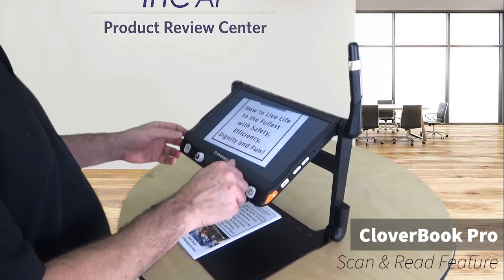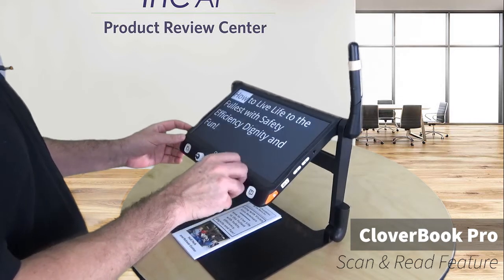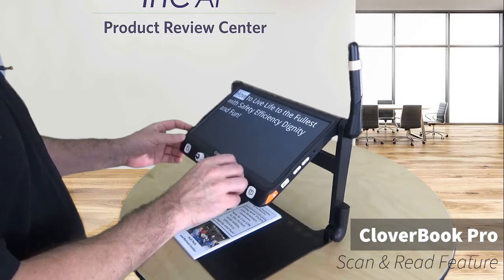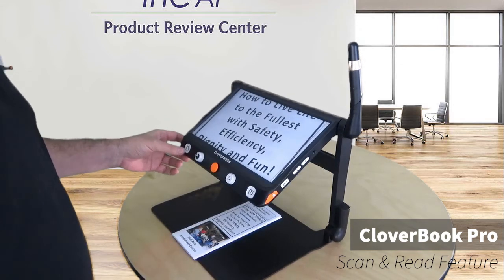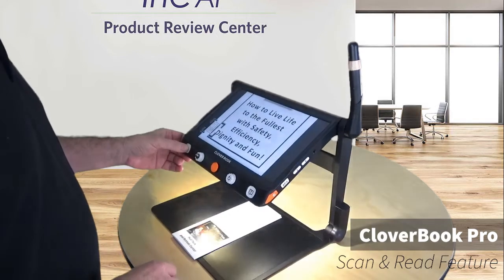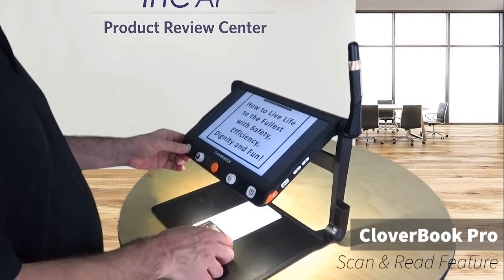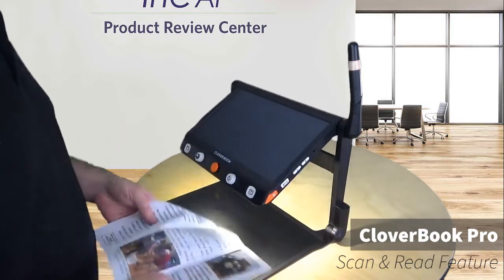I can zoom in on that. I can see different views of it if I wanted to see the computer text. Lots of different ways to view that. And that'll give me just kind of whatever's in the view at the time that I want to have read back to me.